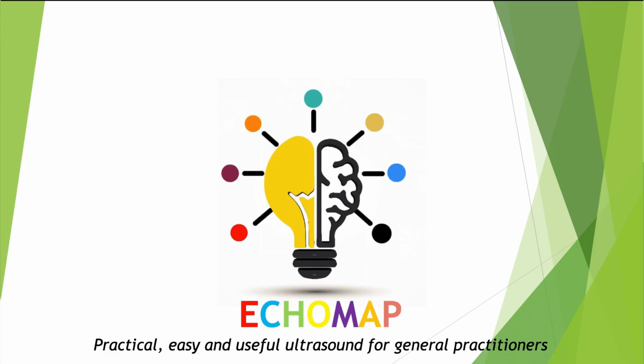We talk about real and authentic clinical cases seen during consultations in a small general practice office. At the end of my consultations, when I come across an interesting clinical case, I record it on video and we discuss it together so we can all improve. And so you can also see that ultrasound absolutely has its place in a general practice office. In fact, it's even essential. I'm sure it's going to become extremely important in the coming years. And I hope that one day every general practitioner will have an ultrasound machine in their office, because it truly provides enormous benefits in daily practice.